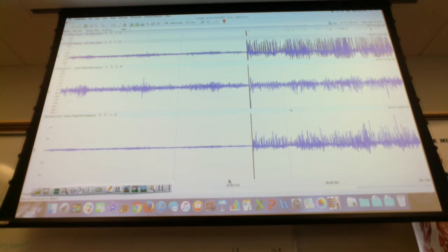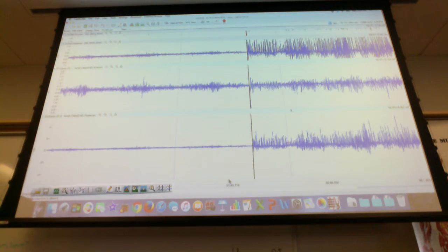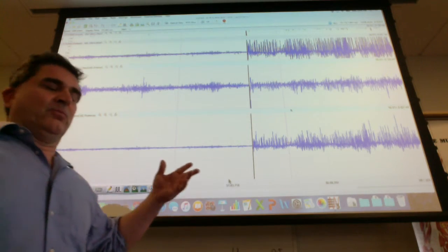So there is more voltage, right? Why is there more voltage? What's generating the bigger voltage? More firing. The firing rates do change a little bit, but what's the bigger thing that is probably happening? More action potentials? First of all, what we're measuring is voltage, and we're measuring voltage because the cells are, of course, depolarizing. What happens if I try to lift more and more weight?